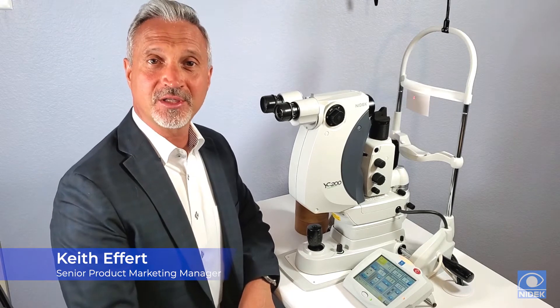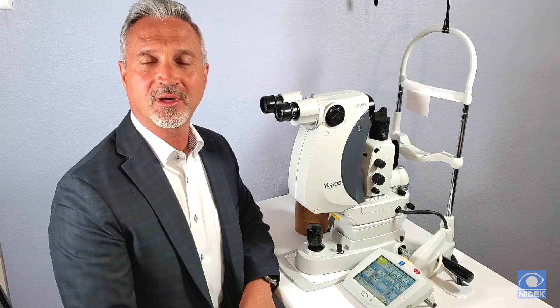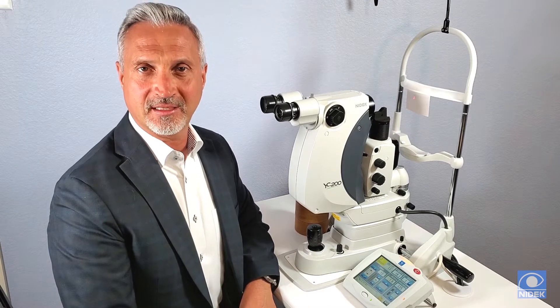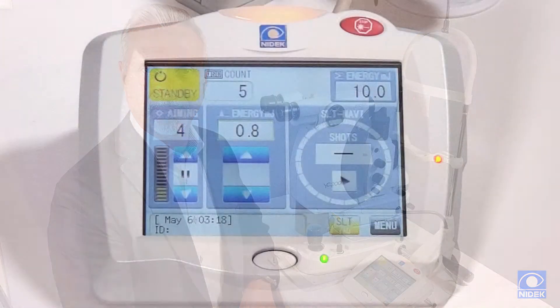Hello, my name is Keith Eppert with NIDEC. Today I will provide you a brief demonstration of the new NIDEC YC200S Plus YAG SLT laser system.